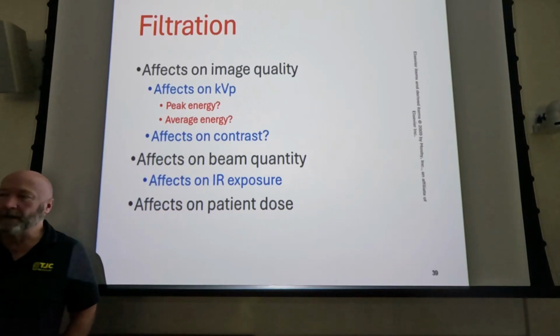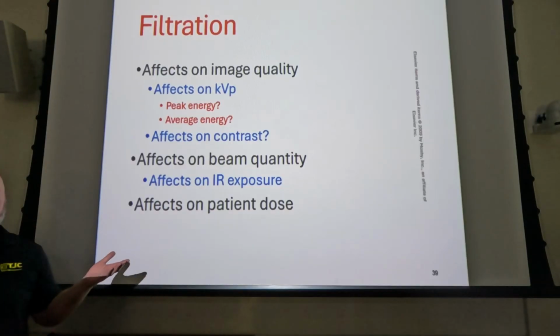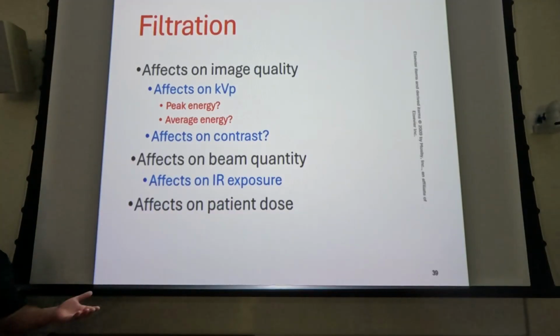So whenever they do the annual inspection, they come in and make exposures. It's quality control again. Last year they set a technique of 70 kVp at 10 mAs, and at 70 kVp, your exposure to your mAs is about 5 to 1, so it'd be like 50 milliroentgens.